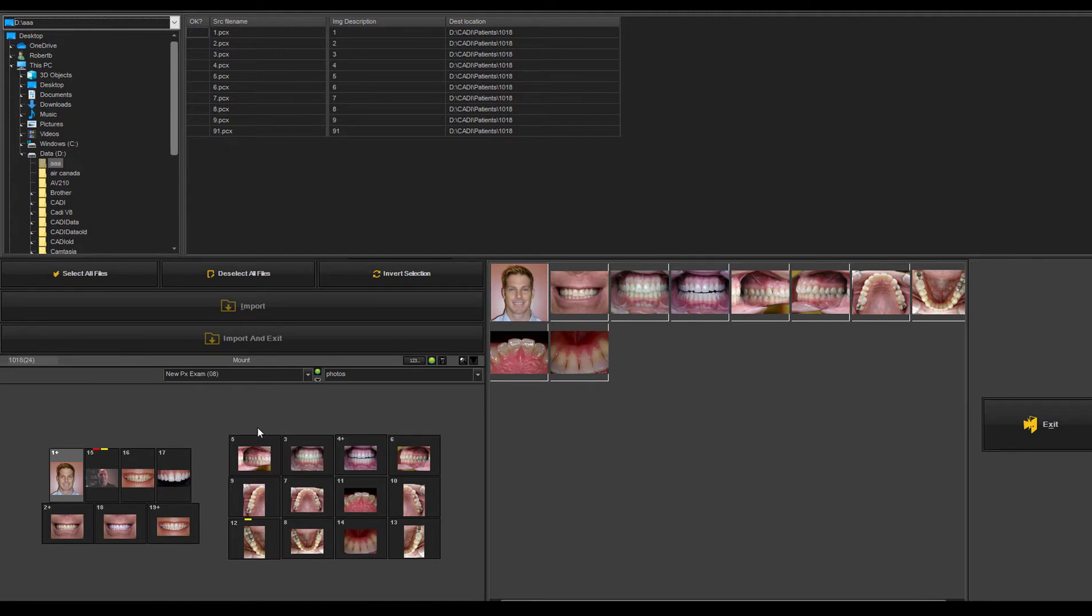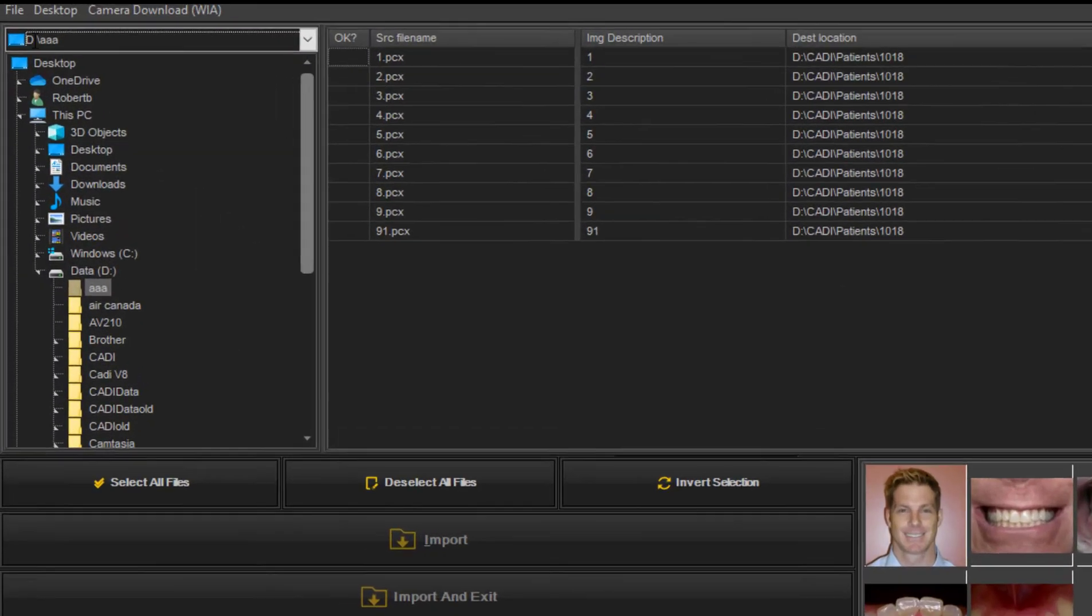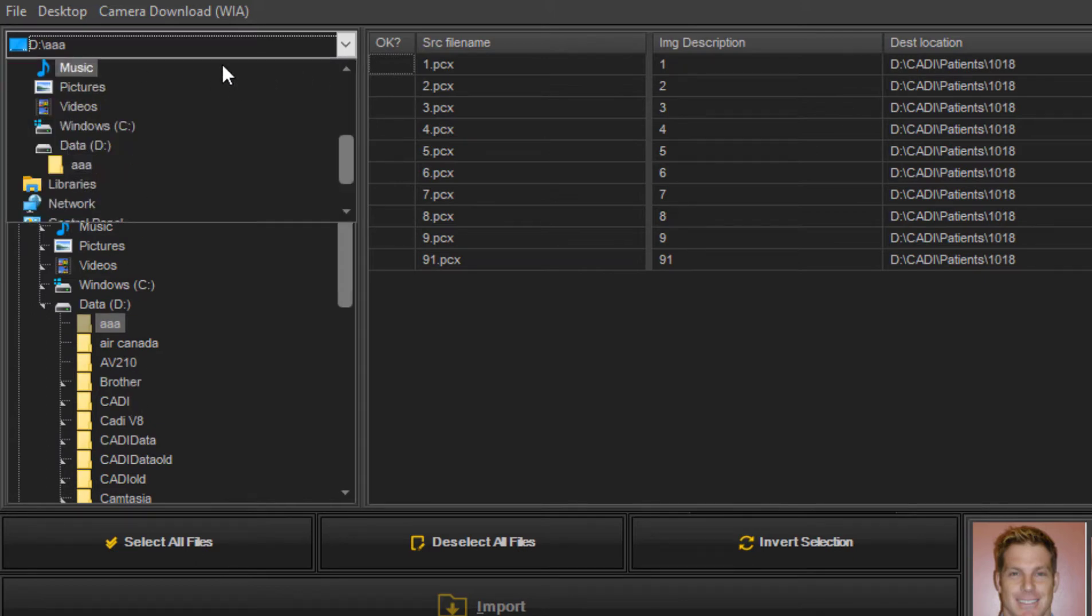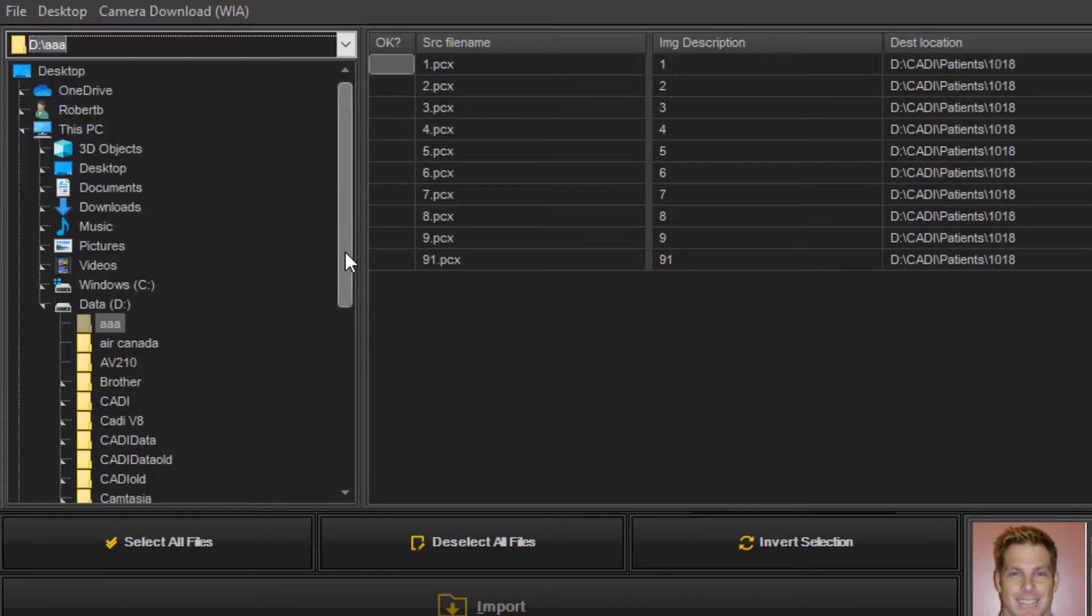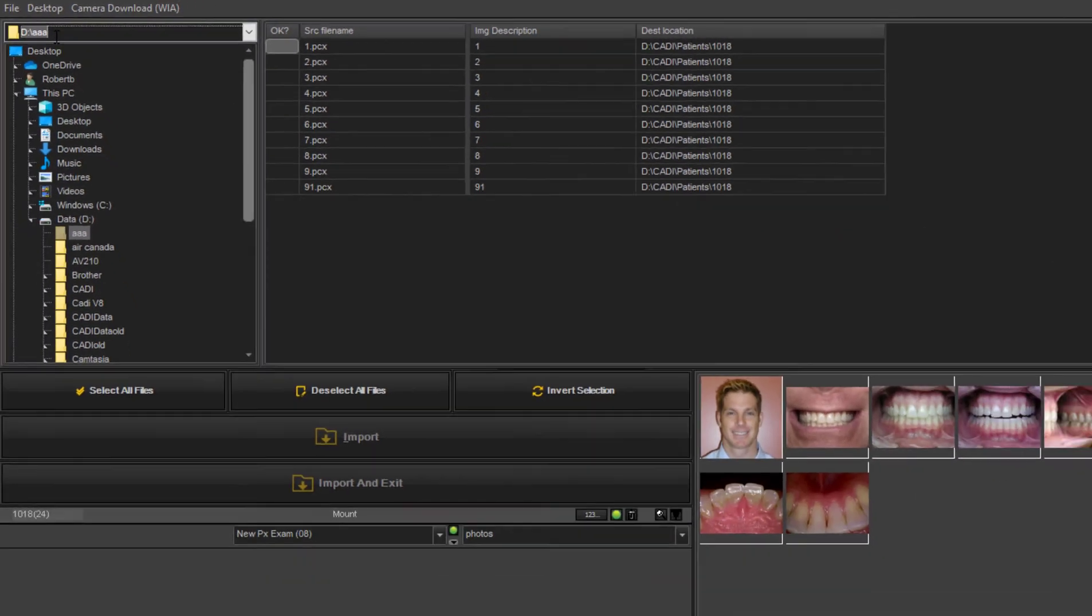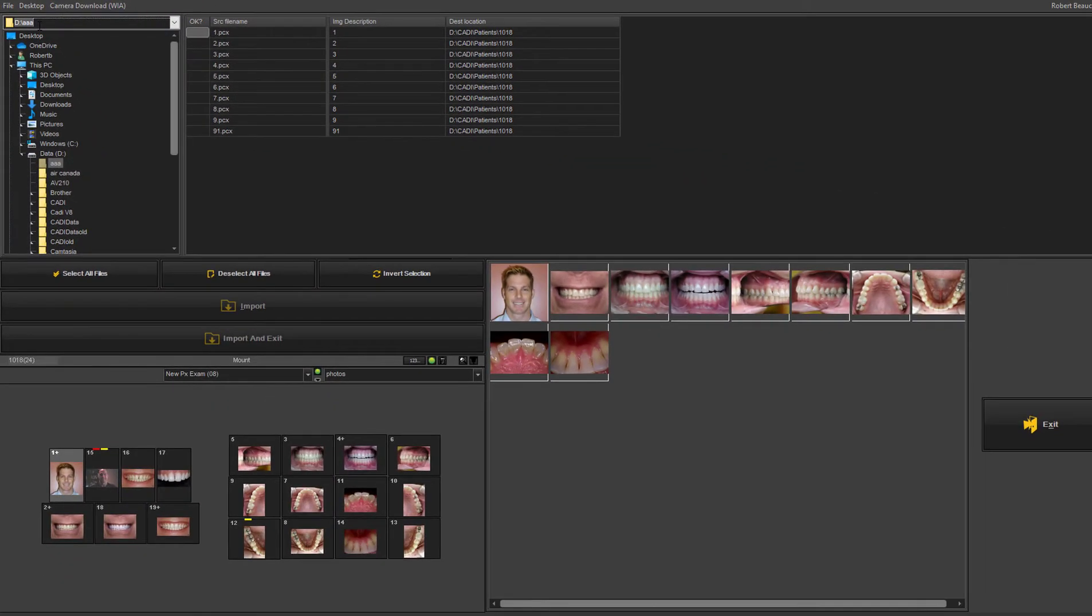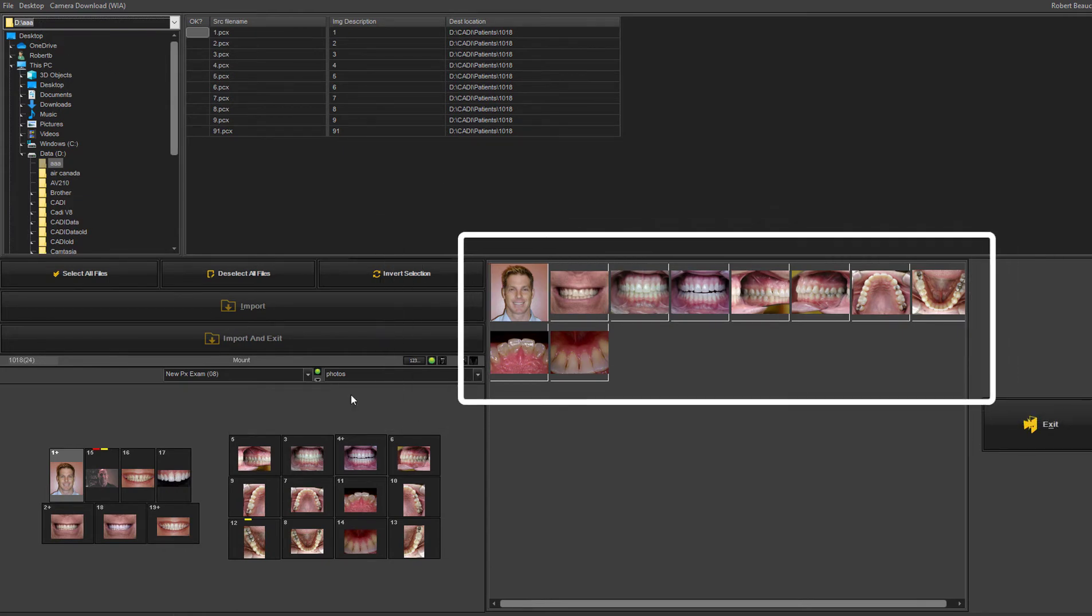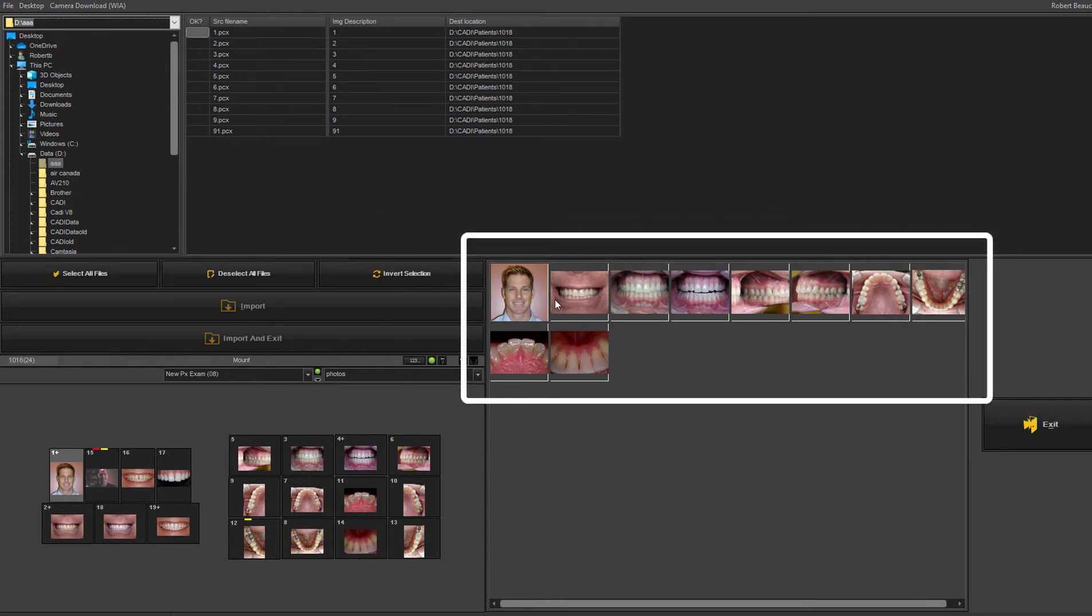So once you click on that icon, you can then source your camera or your card reader here just by clicking and trying to find it through the tree. But once you've done this, the software will remember the last place you went and automatically open that area and automatically load the images that were taken.